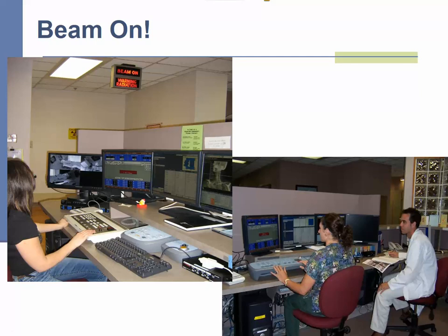So we just wanted other staff to be aware of that in the event you need to come down or communicate to a team at a console area, it's really important that we don't engage the therapists that are driving, because any distraction could perhaps cause an unusual occurrence or an error to occur while they're actually delivering treatment. So there are often other therapists situated at the console area that could help you, or worst case scenario, you might just have to leave a message and the team can get back to you when they are able to do so.